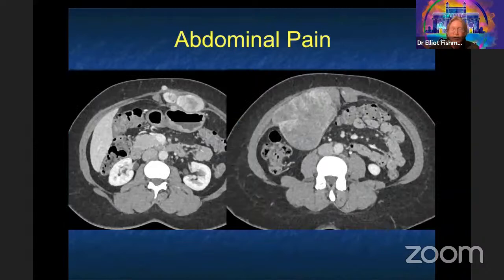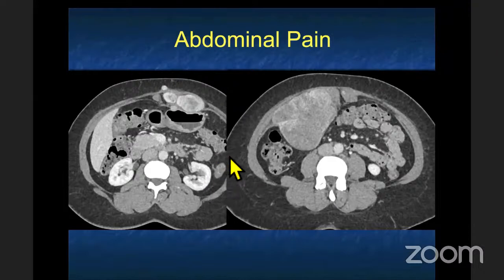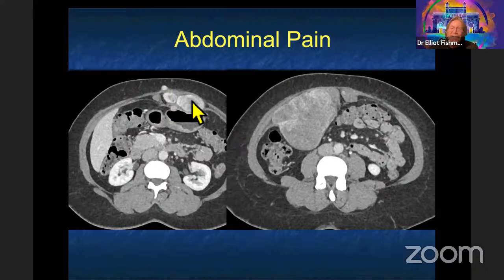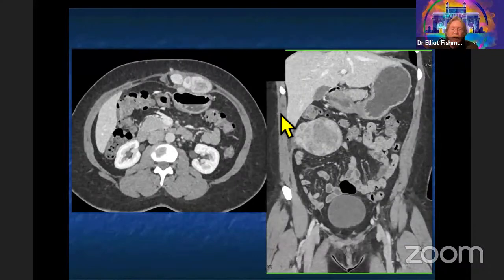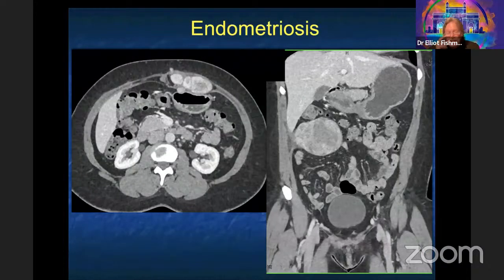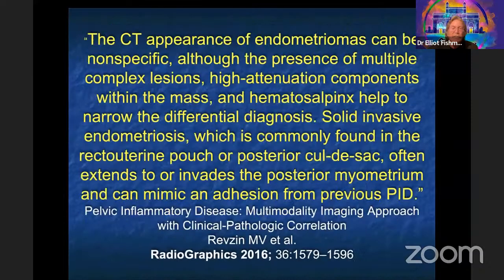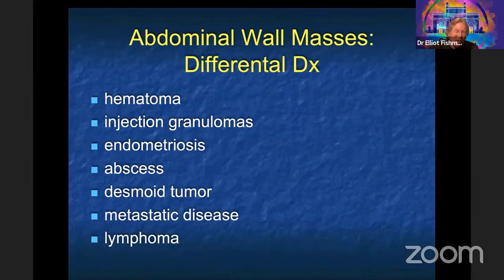Next case: 30-ish year old female with abdominal pain. More than 95% said desmoid; one said endometriosis. There are masses in the rectus muscle — enhancing masses. Multiple enhancing masses in the abdominal wall: I think about desmoid tumors, sarcomas, but endometriosis gives you enhancing lesions, typically in patients who've had prior C-sections or prior surgeries. There's a wide differential for abdominal wall masses, but endometriosis is one of them — a great diagnosis to make.